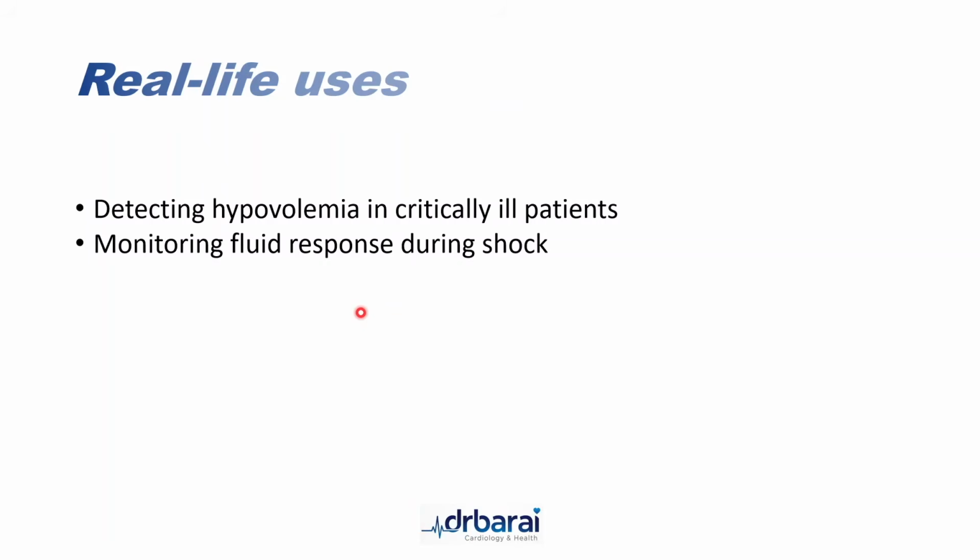If the fluid responsiveness does not work, if I find that LVOT VTI has not changed even after giving fluid, we will think about something else. We may give some inotropes, for example. In case of valvular heart disease, the severity can be detected with this LVOT VTI.